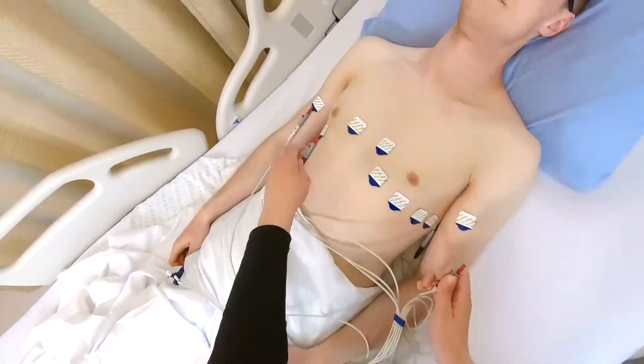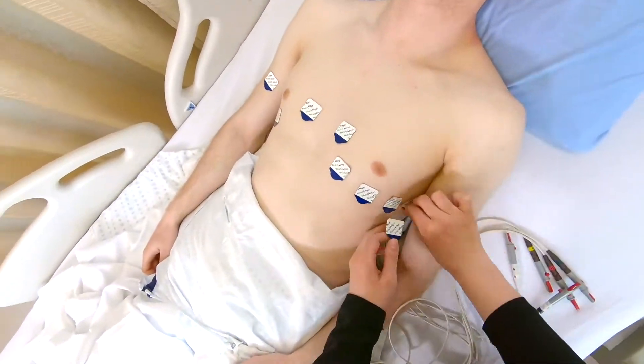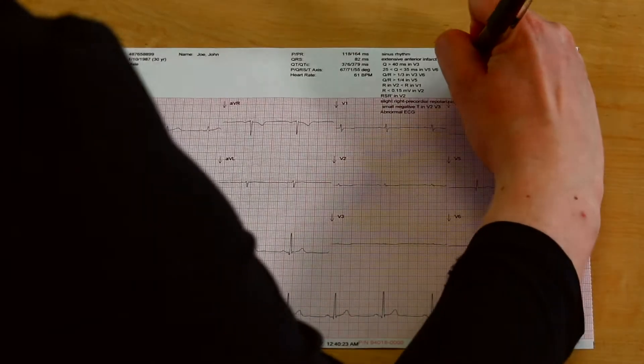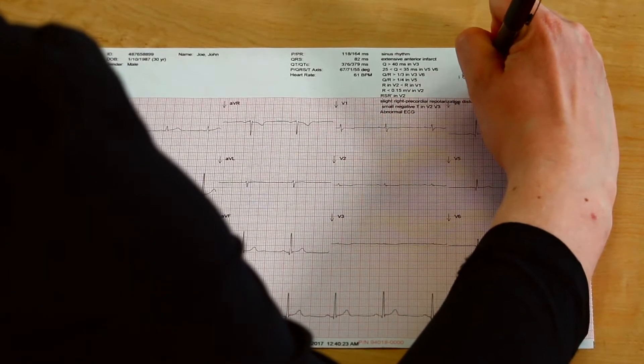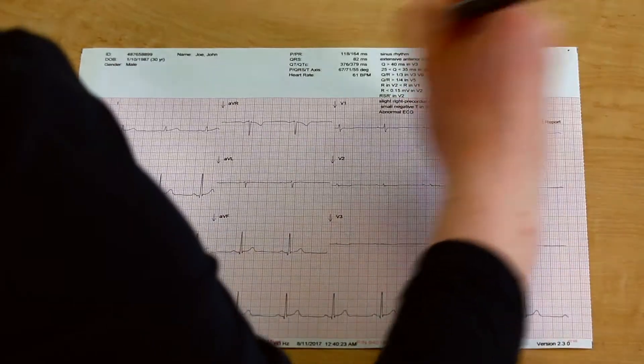Disconnect the equipment and remove the leads. Label the ECG as an 18-lead and ensure you change the lead placement on the paper.